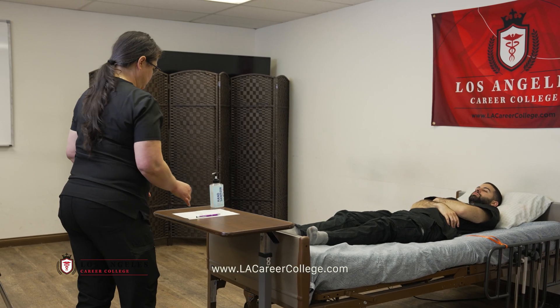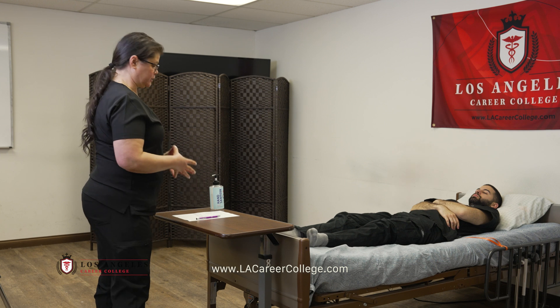In order to pass this skill, you must document a blood pressure within six millimeters of mercury of the RN evaluator's calculation.